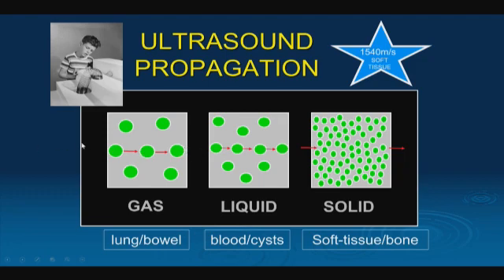So when the sound wave interacts with this molecule and energizes it, this molecule needs to bump into this one and this one into this one to actually have effective transmission. But because these molecules are so widely displaced, the energy fizzles out before it even gets to the next one, and that's why we see a big black shadow or a fuzzy shadow when sound interacts with air-filled structures, such as the lung and the bowel.